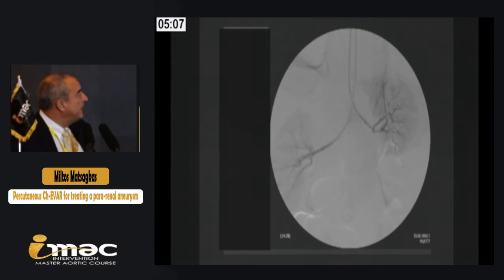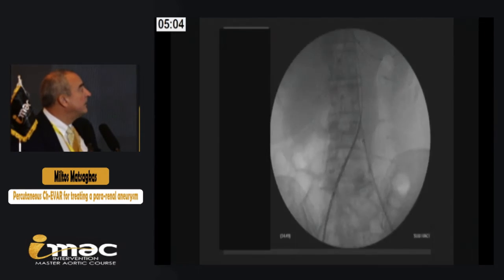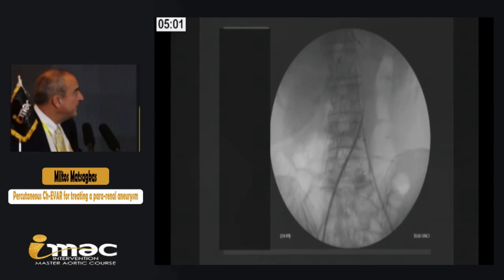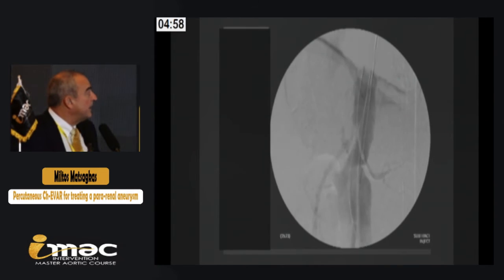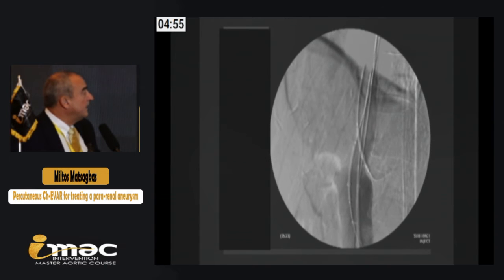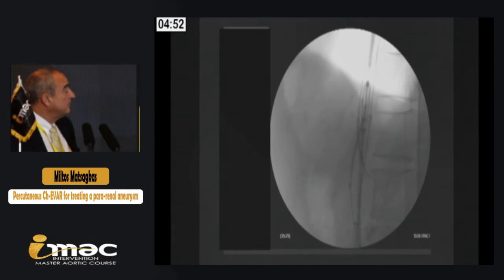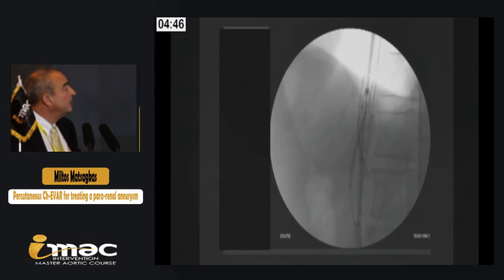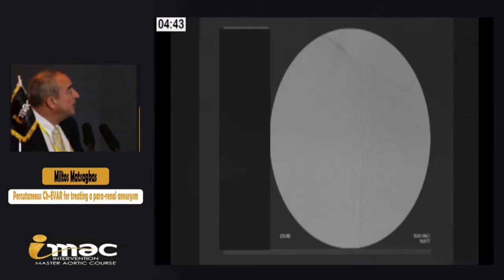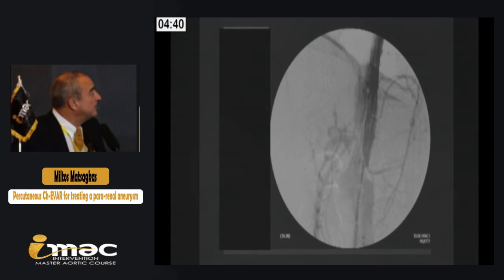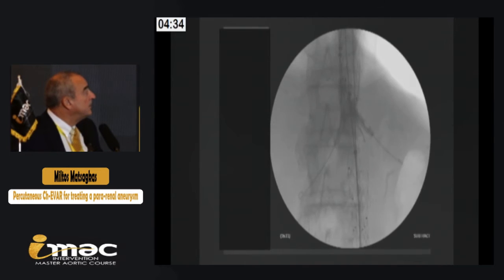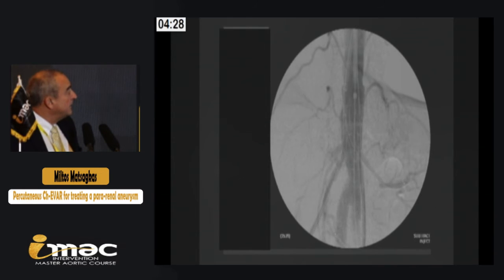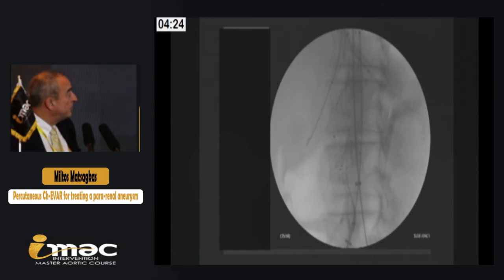The two Rosen wires are in place, confirming good position. Then the INCRAFT device is coming from the right femoral artery. You can see here the angio to define the position of the superior mesenteric artery, and opening up the aortic device with the sheaths inside the renal arteries. A confirmation angio follows — then the full opening of the device, ballooning of the stents and of the main device, and the confirmation angio confirming good placement.